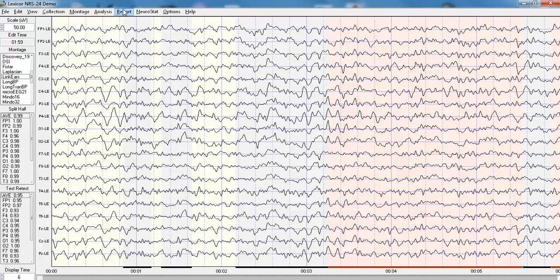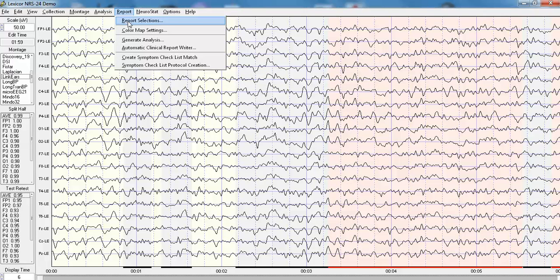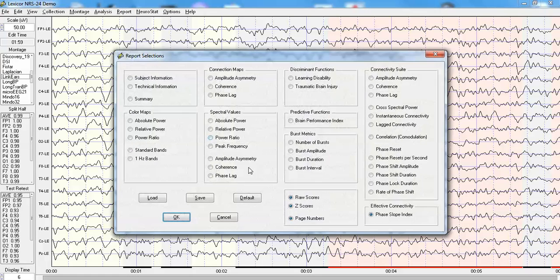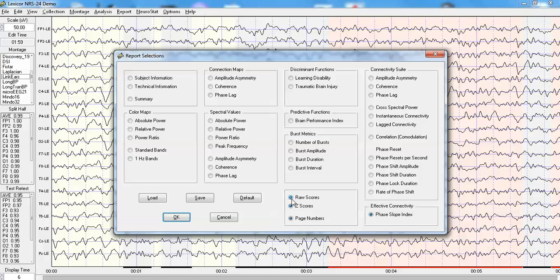Then you go to Report, Report Selections. In this case, I have the Phase Slope Index for both raw scores and z-scores. I'm going to deselect the raw scores at the moment and compare coherence to the Phase Slope Index.